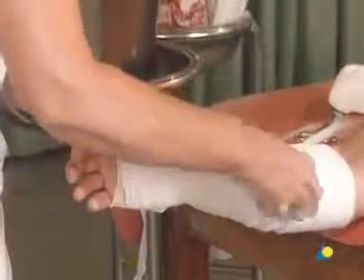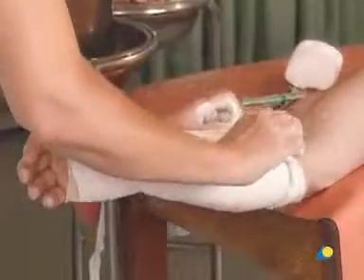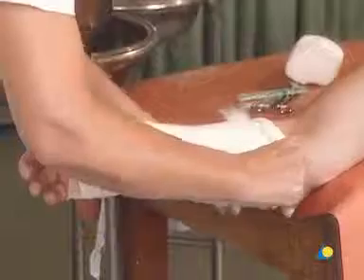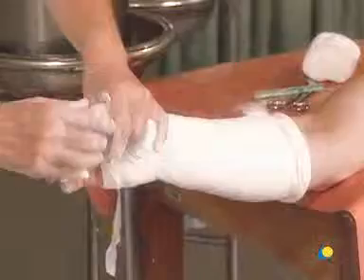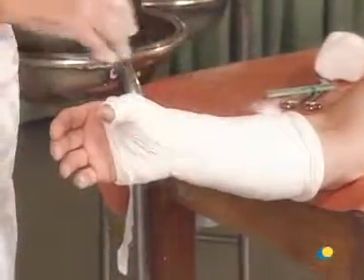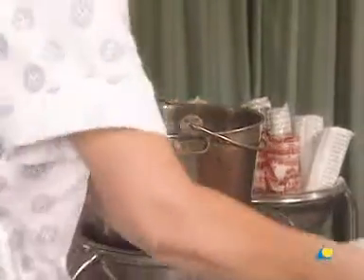The bandage is then gently rolled on towards the elbow, giving an overlap of 50%. A slight amount of cotton wool at the ends of the cast remains uncovered. The stockinette is now folded over the cast at both ends. A second plaster bandage is applied, beginning where the first bandage ended, to ensure a uniform thickness of the cast and secure the loose ends of the stockinette.